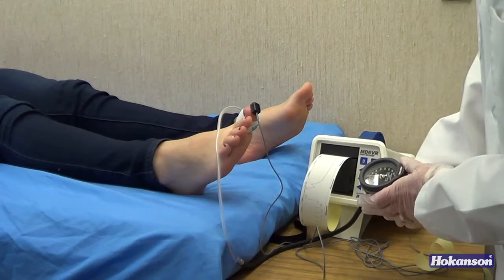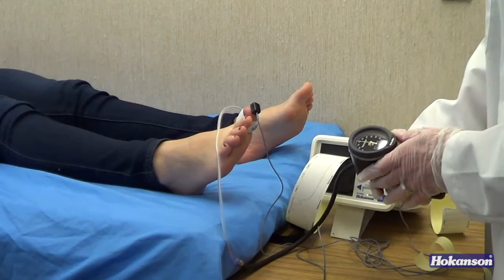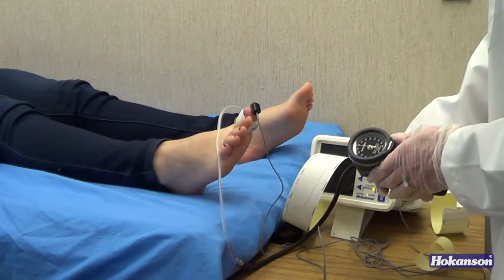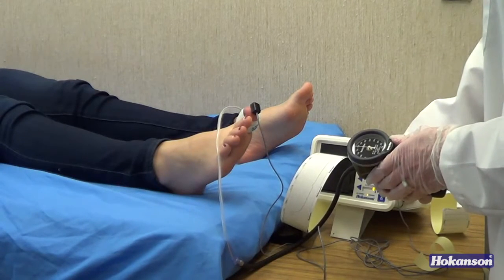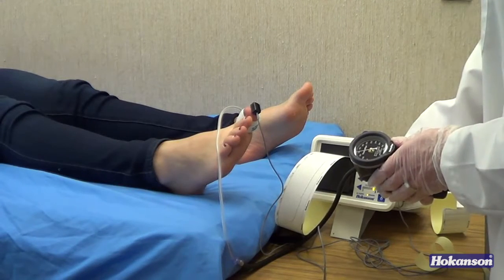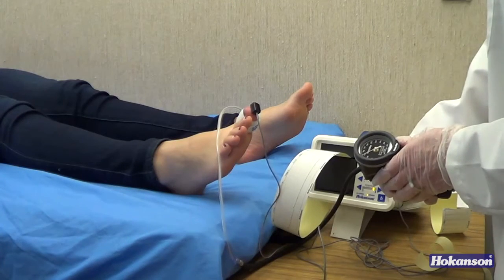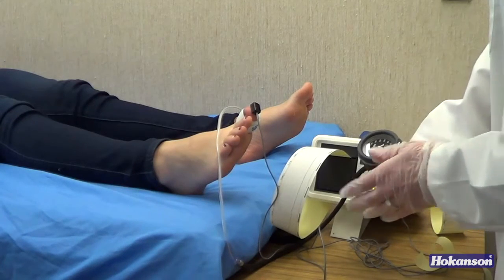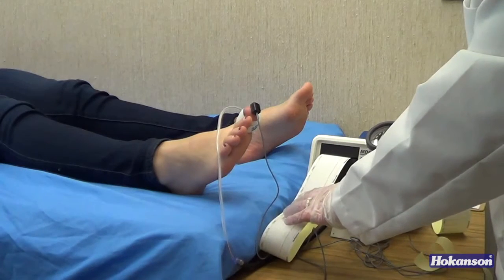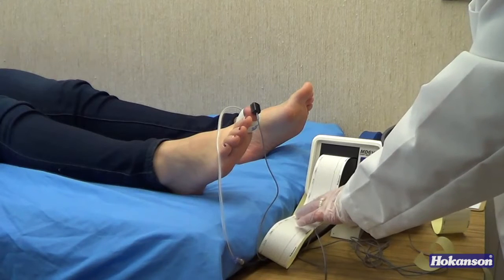Deflate the cuff slowly. On the DS400, you pull the trigger open just a little bit and it will bleed slowly. It will bleed at about 1 to 2 millimeters of mercury per second. And we do that slowly until the waveform returns. When we see a pulse, we stop deflating to see if the pulse returns.